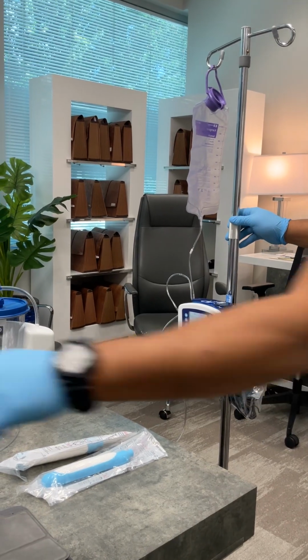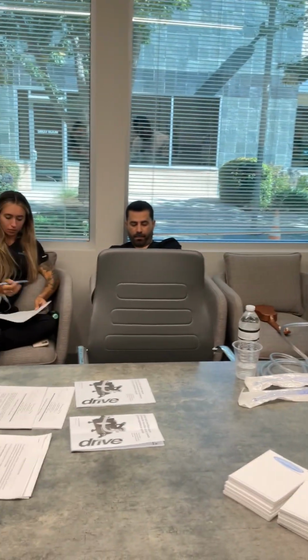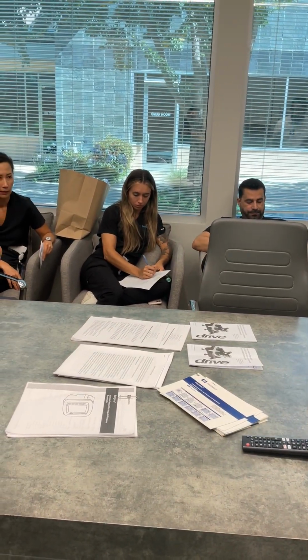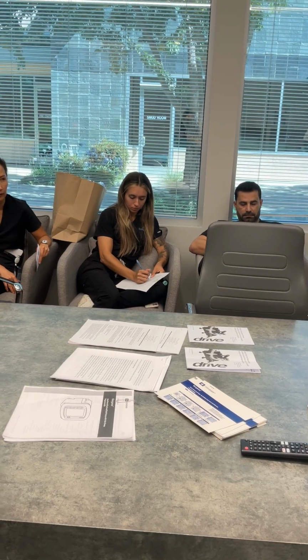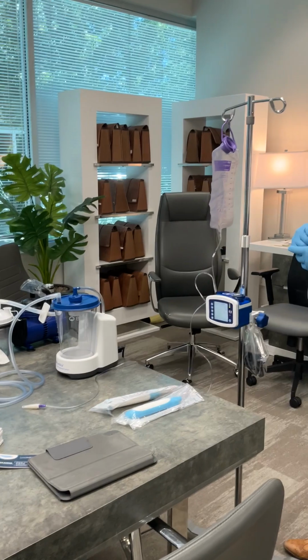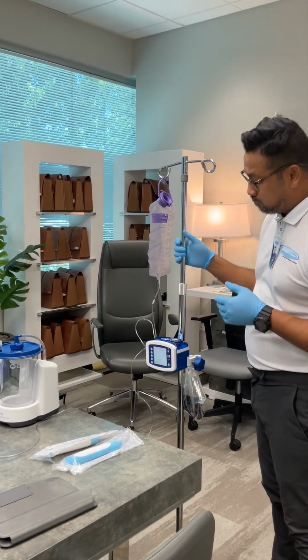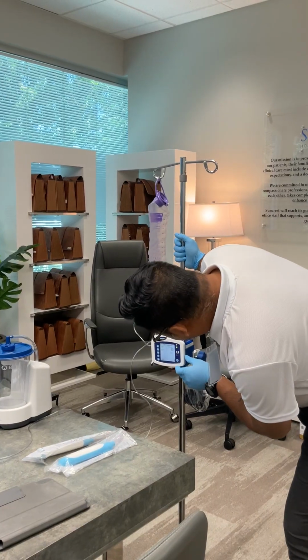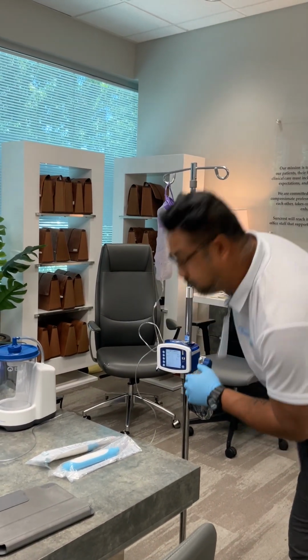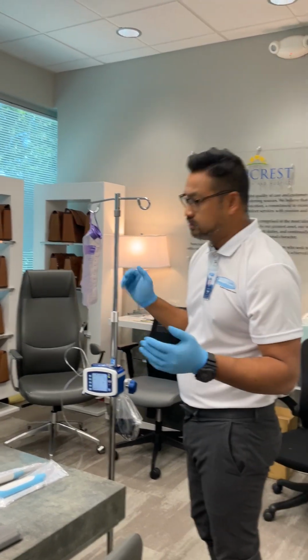Normally we print out a packet that looks like that, and there are also instructions in multiple languages that we give them on how to set it. The main items that we need are the total volume to be delivered, VTBD, also an hourly rate, how many milliliters per hour, and then we also want to know the quantity that they like to have per 12-hour session or 24-hour session, whatever it is.